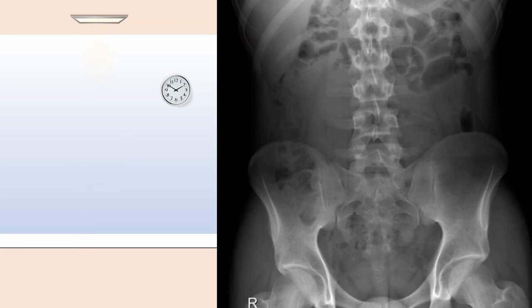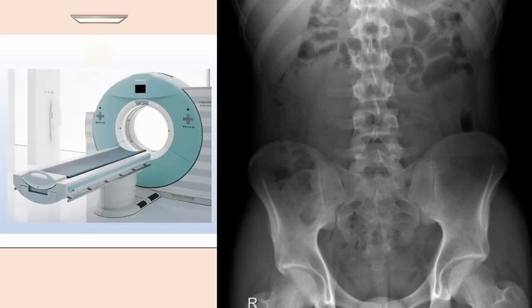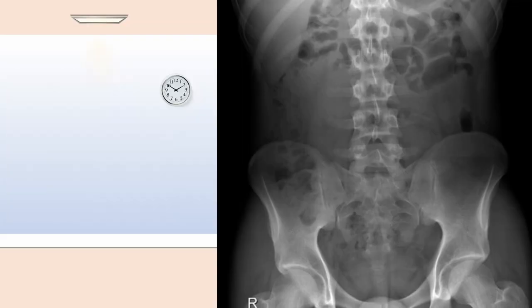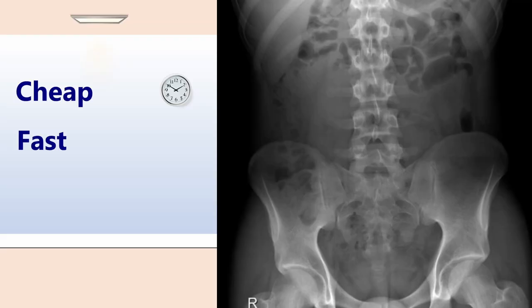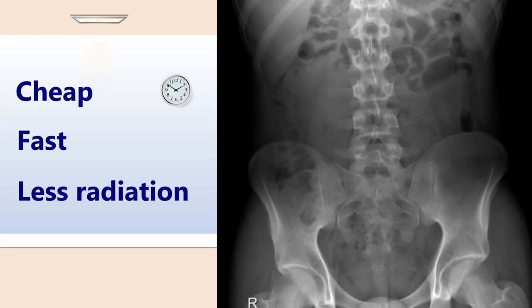In modern medicine, a CT scan of the abdomen is much more sensitive and specific for different pathologies. Despite this, it's still an essential skill for a doctor to be able to interpret abdominal x-rays. In their defence, abdominal x-rays are always cheaper, faster, and involve less radiation exposure than CT scans.